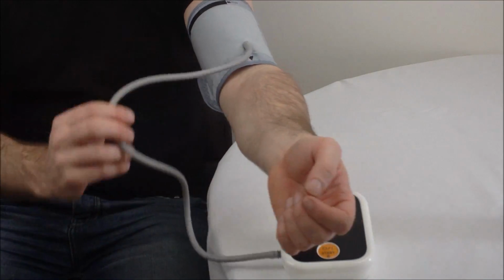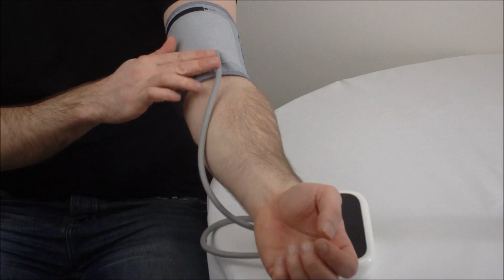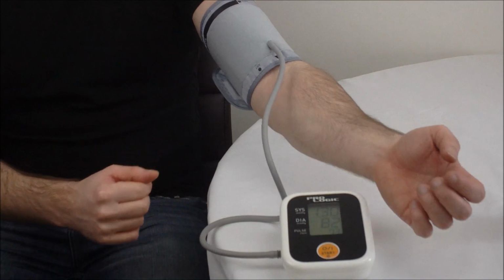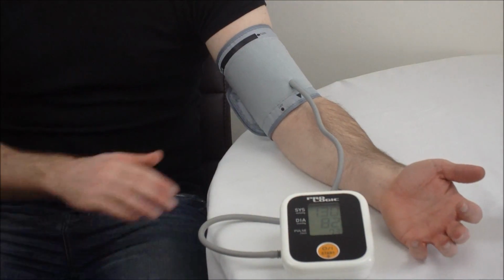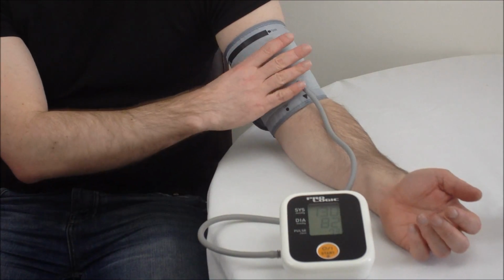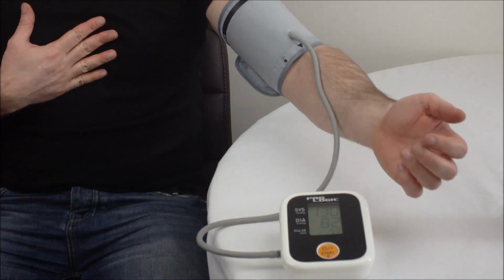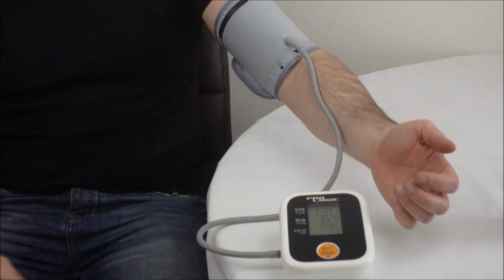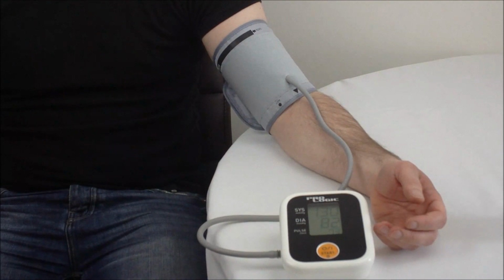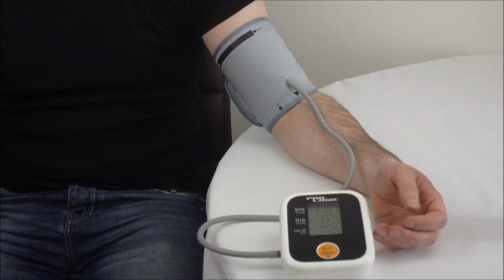It's very important that when you put it on, the writing should be facing you. So where the tube goes into the cuff, you want that resting over the vein in your arm when you usually would have to give blood if you went to the hospital for a blood test. This arm is going to be rested on a hard surface like a table. Now what you're looking to get is to have the cuff in line with your heart. Now you may need to raise it up with a cushion underneath, but it's important that all of the weight is taken out of your arm and your arm is fully supported. Then you're going to sit there for 5 minutes, nice and peacefully, and relax.